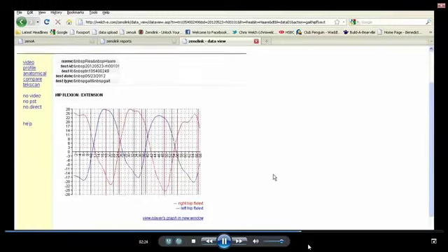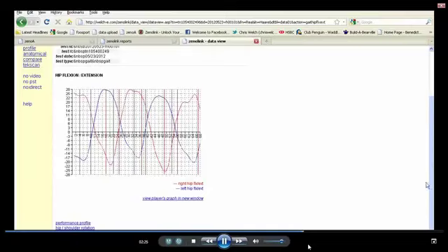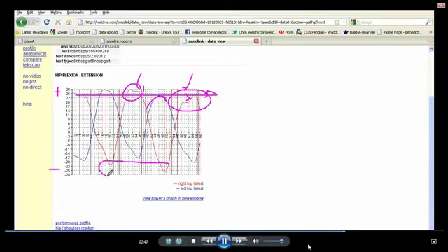We'll take a look at hip extension, flexion, extension again here, flexion, extension. In this case, we see hip flexion about equal, fairly symmetrical. The right side, you see these little bumps as opposed to nice smooth. So we get some issues in the right side hip. We also see that the right side hip is extending significantly more than the left hip.